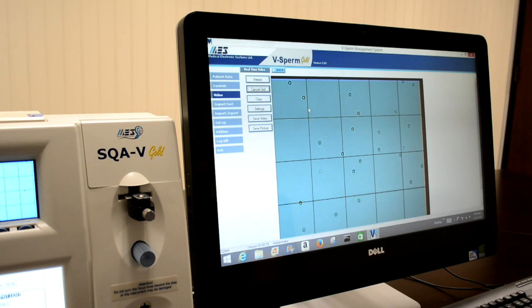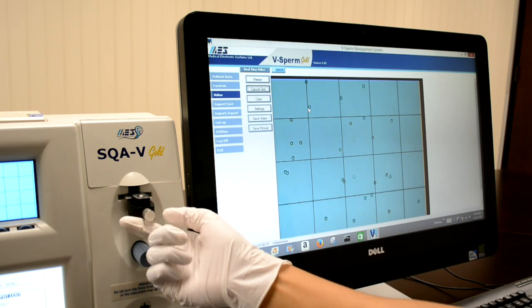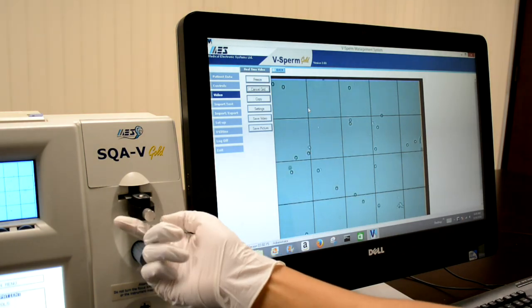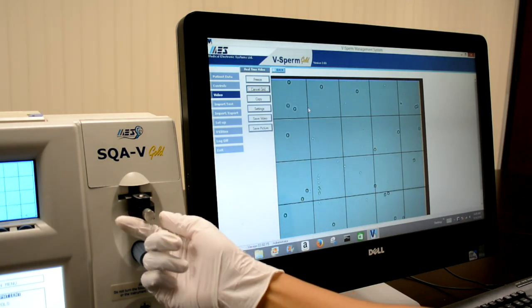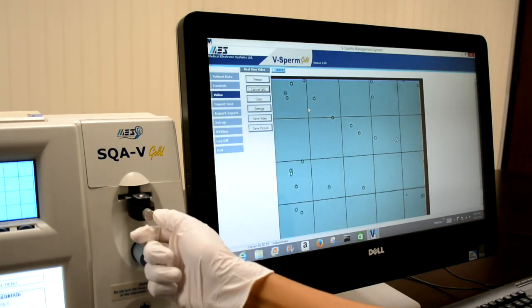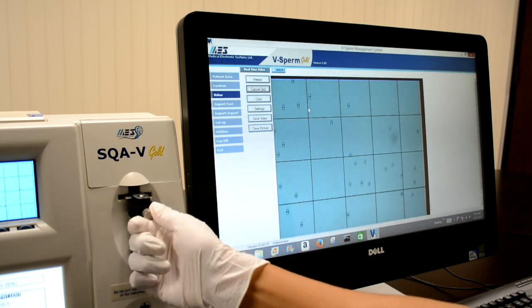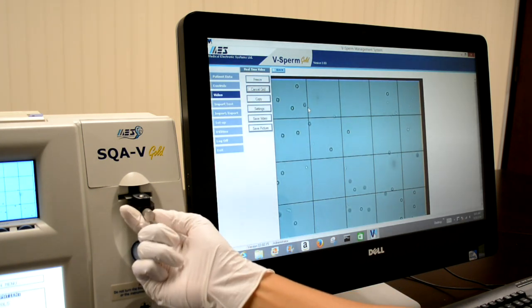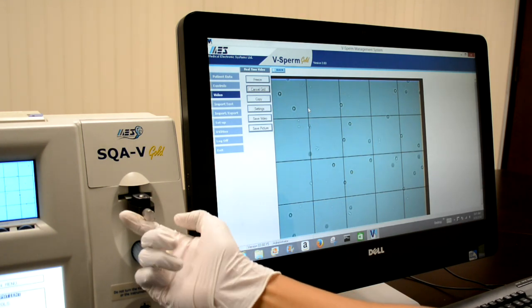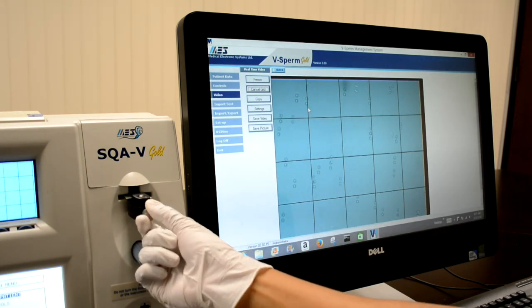The slide adapter allows you to change fields of view by turning the silver knob. When counting, you should select random fields of view and count at least 200 sperm and divide by the number of fields viewed in order to get an average. WHO 5th edition manual instructions should be followed for any manual count.